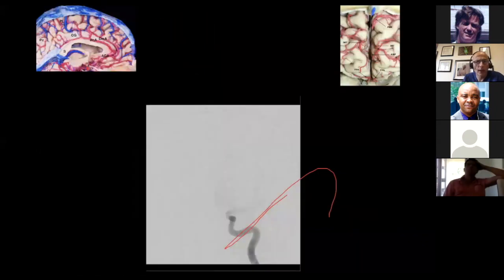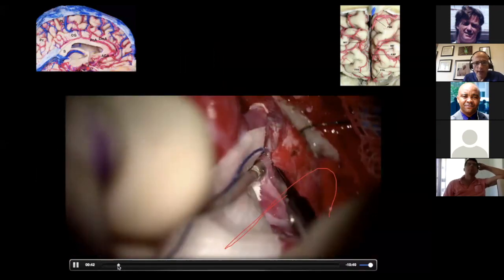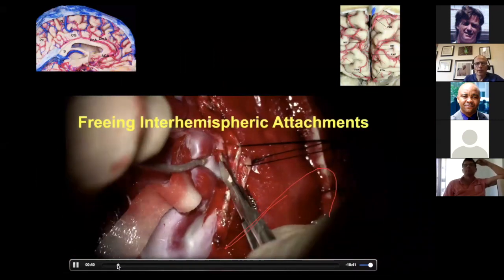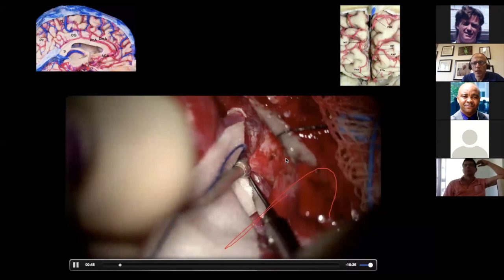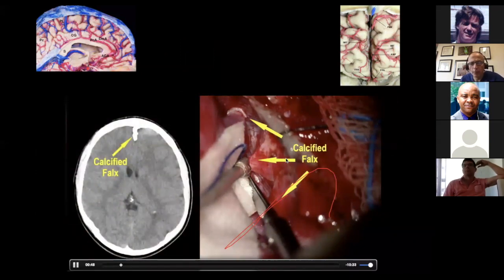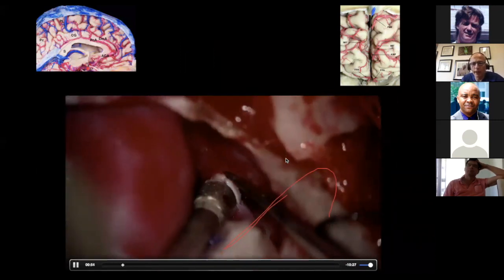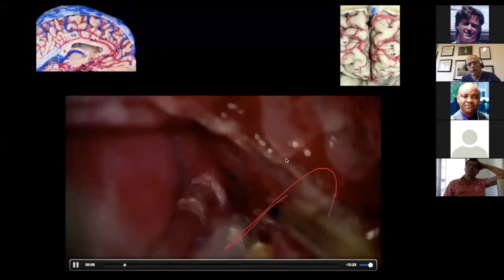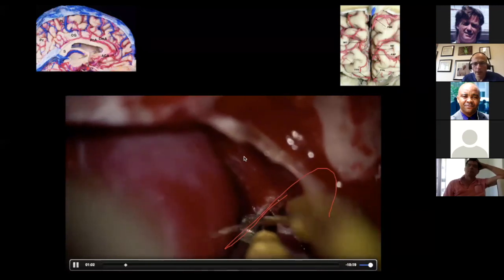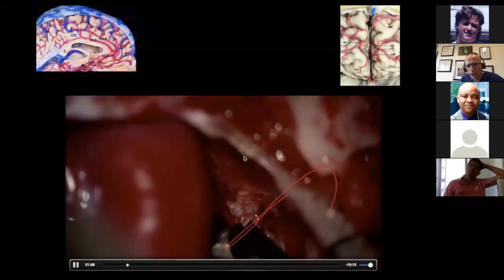So this is a huge AVM. Again, this is the anterior portion of the limbic lobe. So we'll go fast. The most difficult part here is the patient had a strange, huge calcification of the falx. It made surgery at the beginning very difficult because I had to dissect for hours to free the AVM and the veins. See, there are vessels calcified and fused with the calcified falx. But, you know, you spend time and you get it out and dissect it.